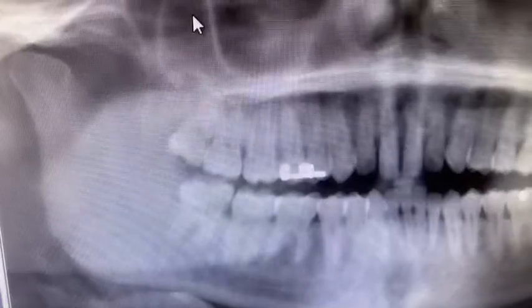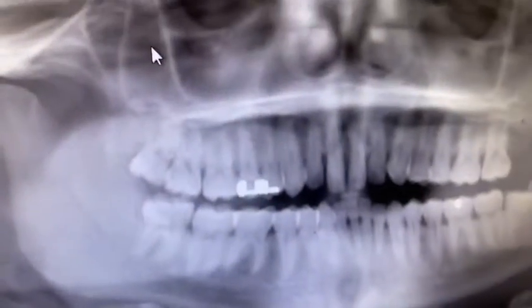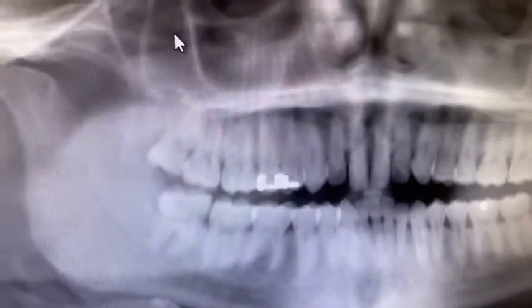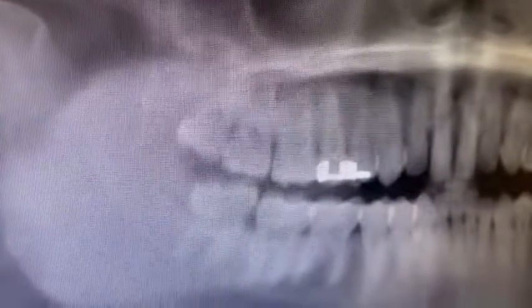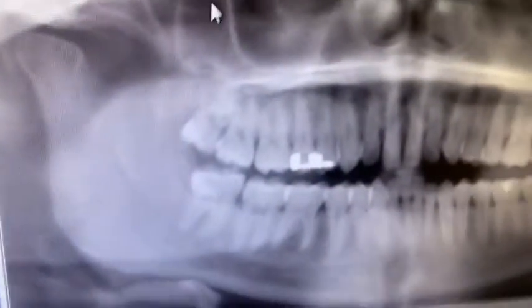Ideally, nowadays with the technology of 3D imaging, like CT scan, if you're able to obtain the 3D x-ray, that would really be helpful for you to see the potential complications, like how many roots the tooth might have. That's where you will be more prepared to handle it.